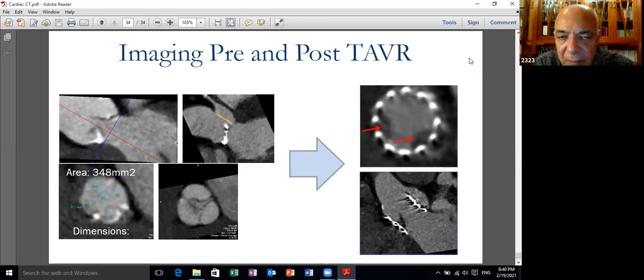Now to the second part of the question: does the presence of extensive calcification prevent me from doing coronary CT angio? No, it doesn't prevent me, but the reliability of the findings will be diminished. Sometimes you get a report saying that because of the intense calcification you cannot evaluate the severity of the lesion.